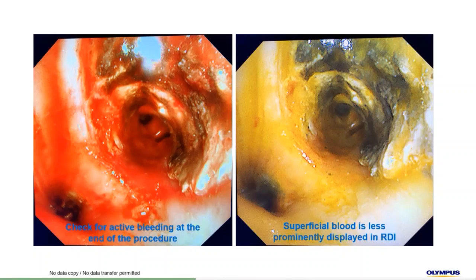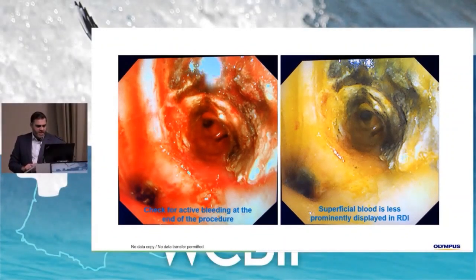In fact, with this lady, she also was very septic and had a lot of pus trapped in her lung and had a collapsed right lower lobe and middle lobe. So I proceeded to laser the tumor away, as you can see here.